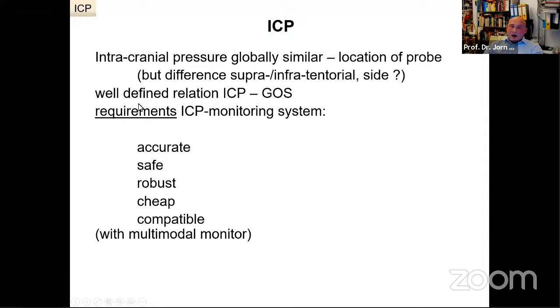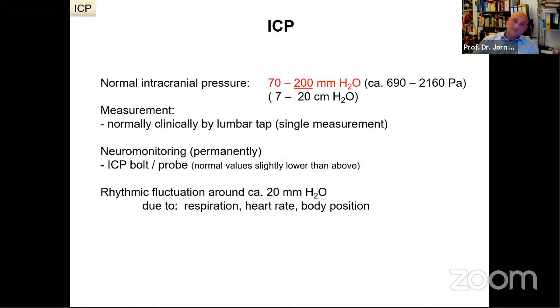But it requires a monitoring system to be used for this entity to be measured, and this monitoring system has to be accurate, safe, robust, cheap, and if you want to integrate it into a wider system of measurement, it should be compatible with a multimodal monitoring system.